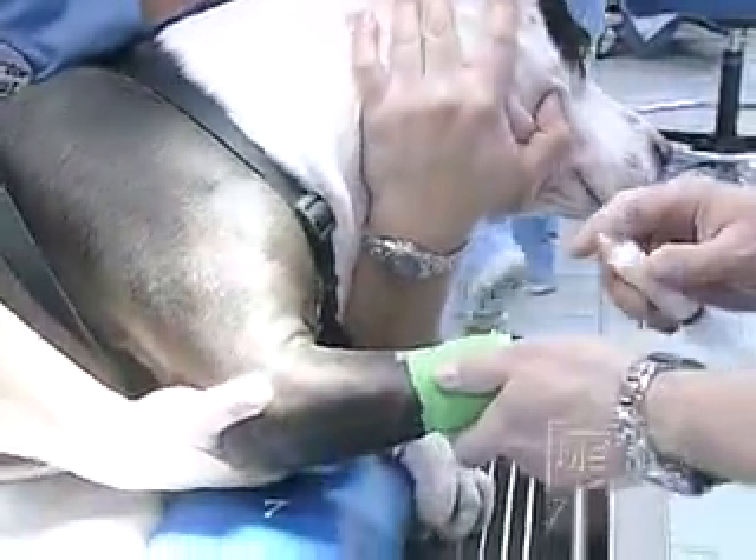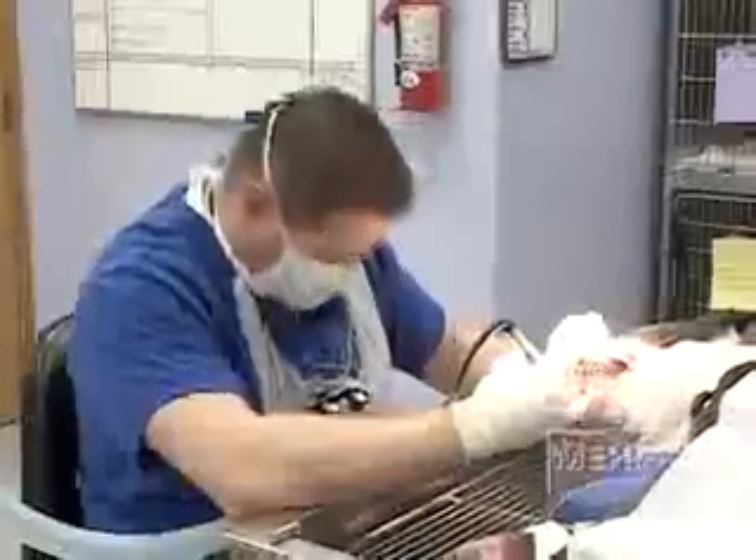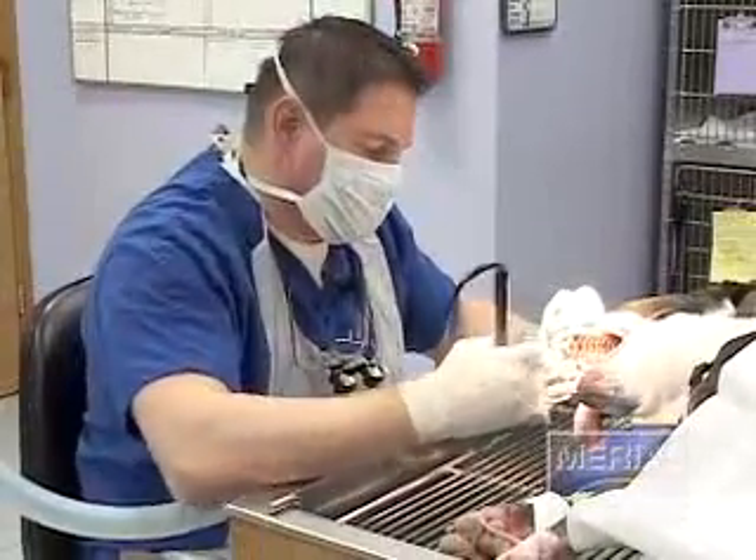Just like within people, dental hygiene is critical as far as longevity of the health of the pet. So today we're going to be doing a professional dental cleaning where we're going to be placing Wauquita under a general anesthesia and doing a professional dental cleaning. There are about 12 steps involved in a professional dental cleaning.